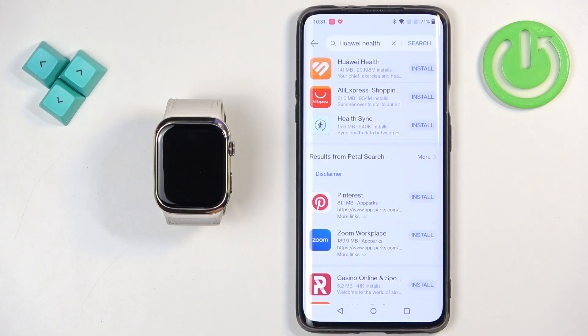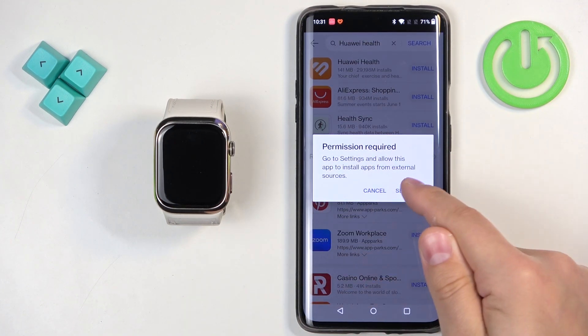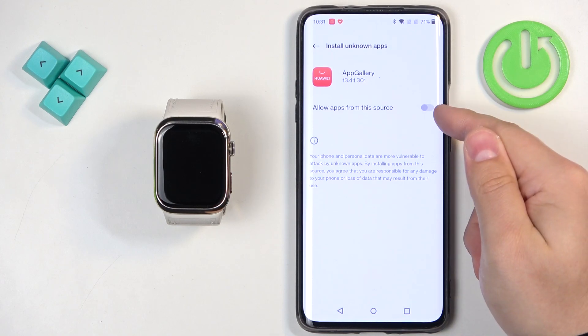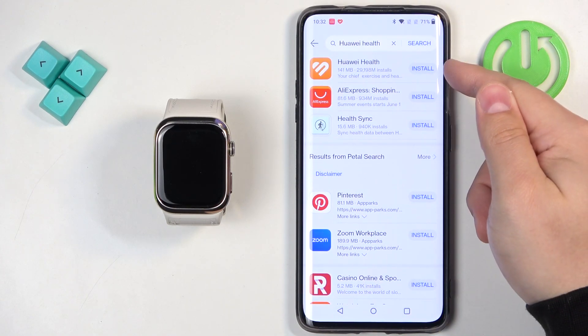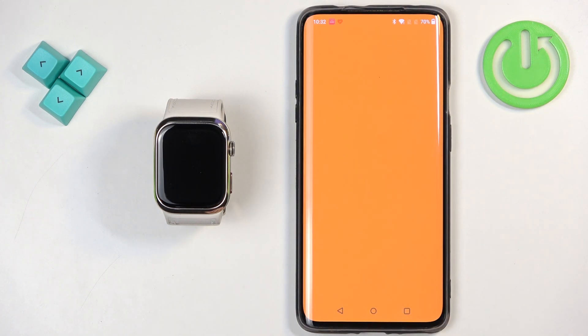You should see the Huawei Health application. Next to it there should be an install button — tap on it. If you see a pop-up, tap on settings, allow from the source, then go back, tap on install again, and wait until it's done downloading. Then you will need to confirm the install again by tapping on install. Once the application is done installing, you will see the open button — tap on it to open the Huawei Health application.